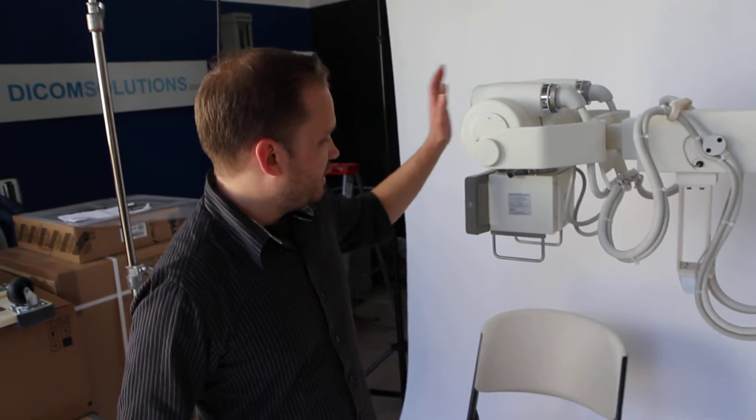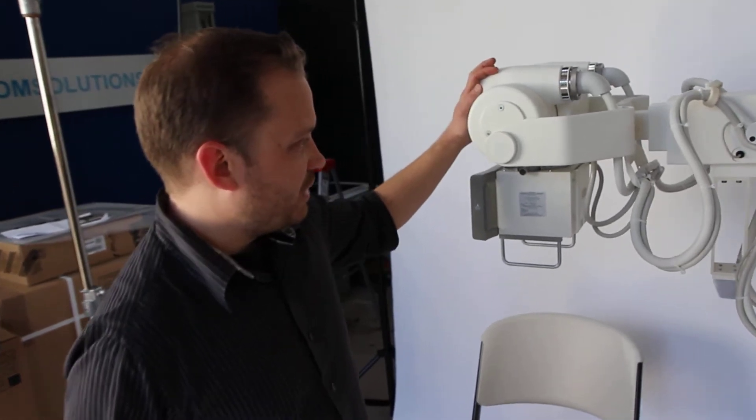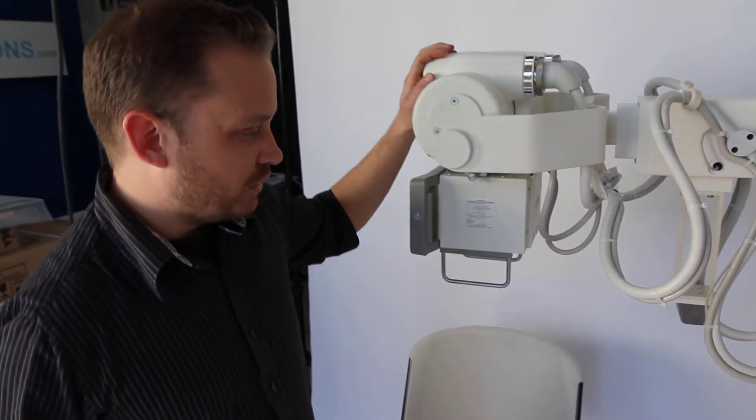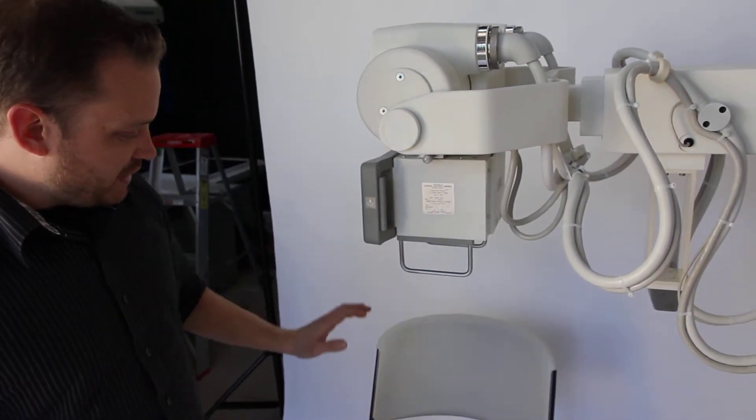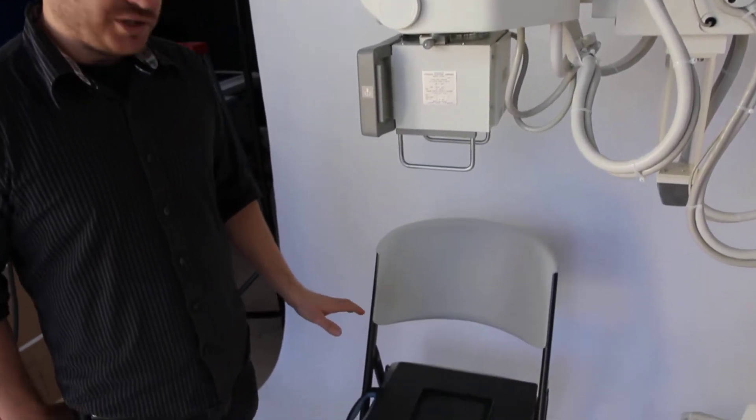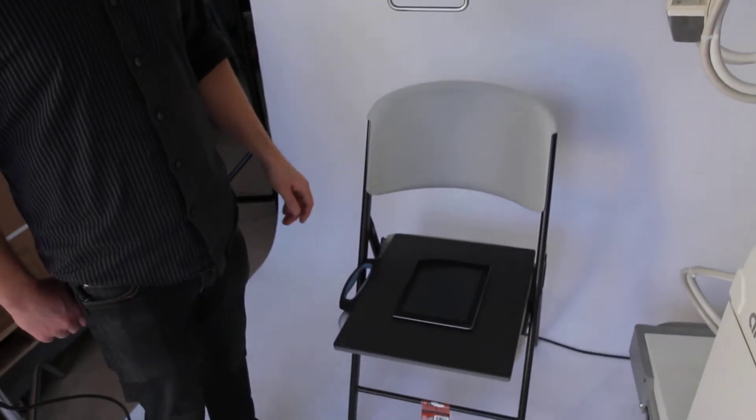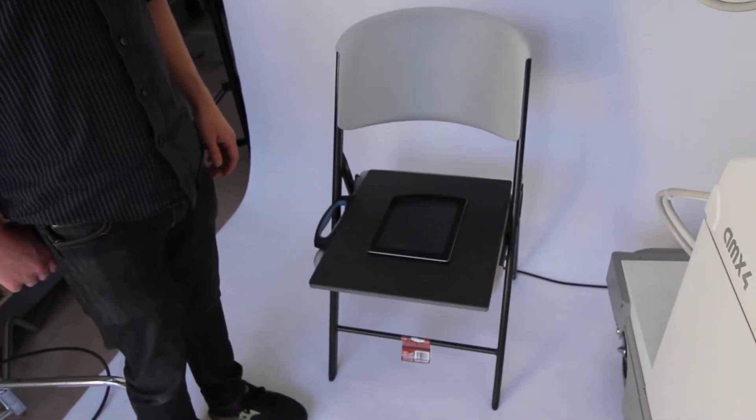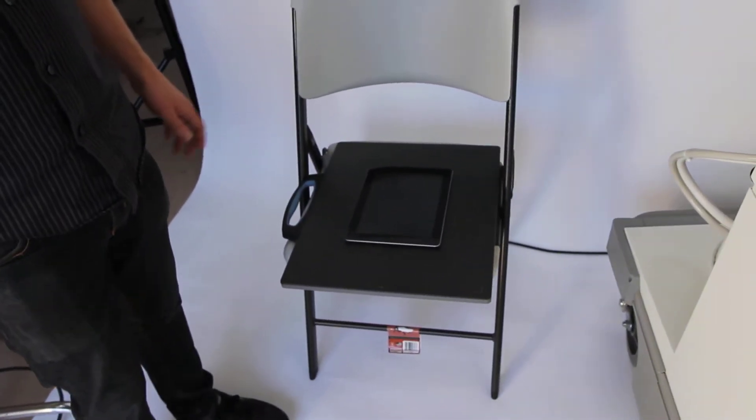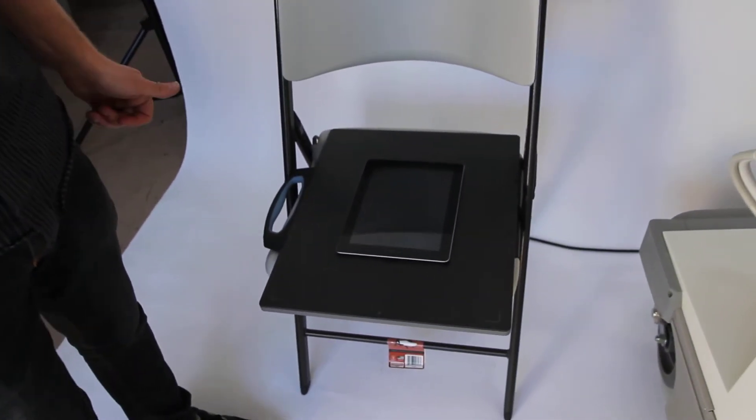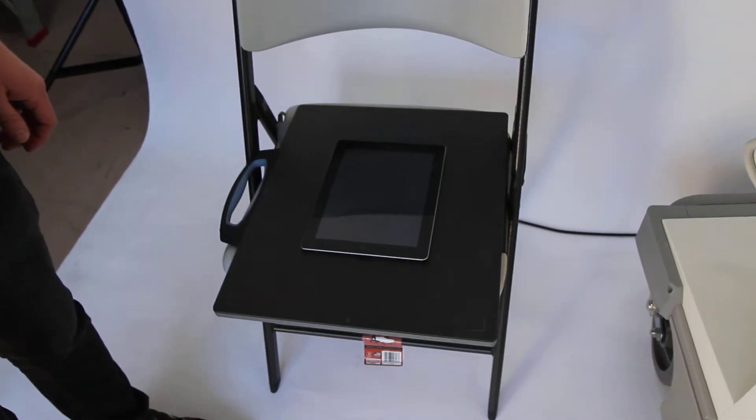As you can see here we have the GE AMX4 Mobile X-Ray System set up, and this is our DR panel that we're featuring today. It's a 14x17 portable panel. It comes in both Gadox and Cesium.